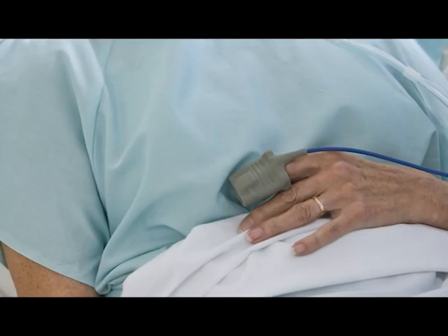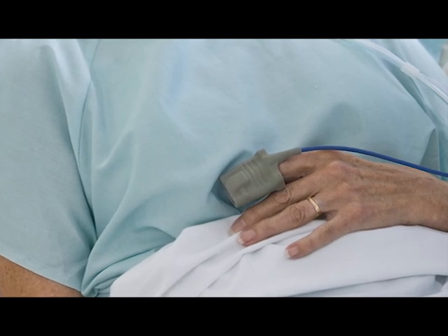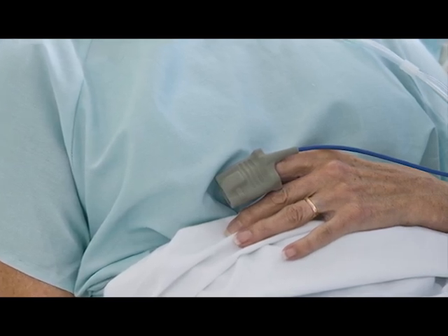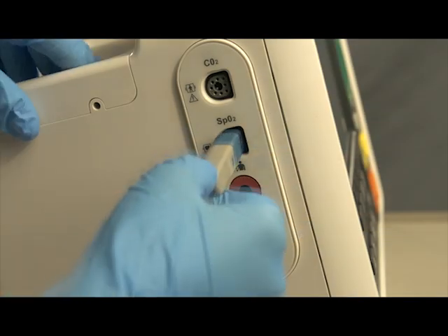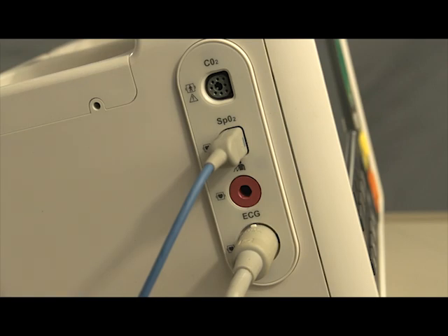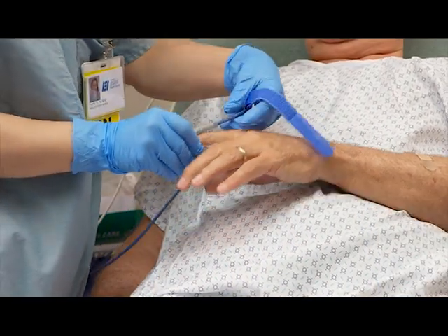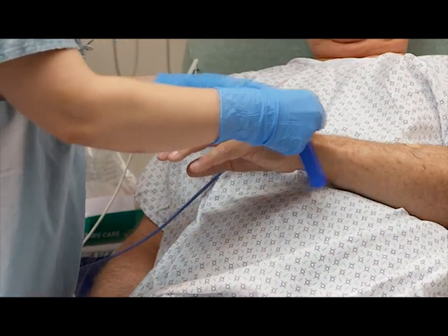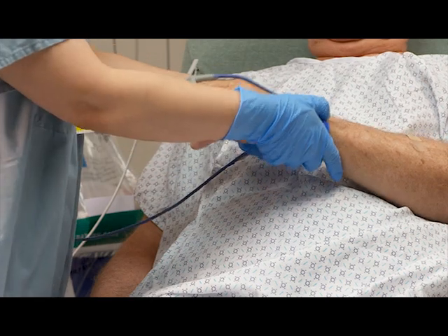Now let's set up for SpO2 monitoring, which is also available in AED mode, if configured. Insert the blue connector into this port located on the side of the DFM100. When choosing a location for the SpO2 sensor, be sure the site has good perfusion. Apply a sensor appropriate to the patient's weight.